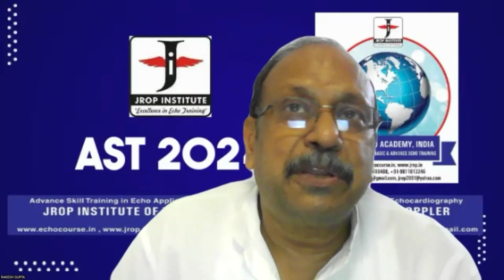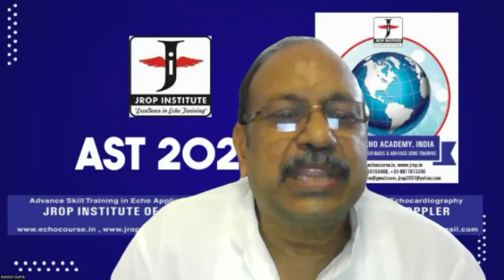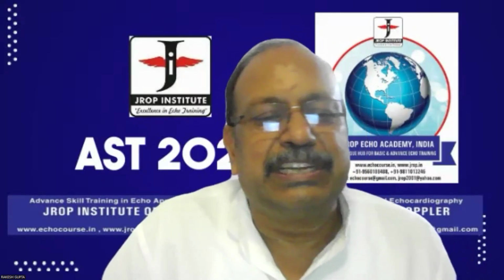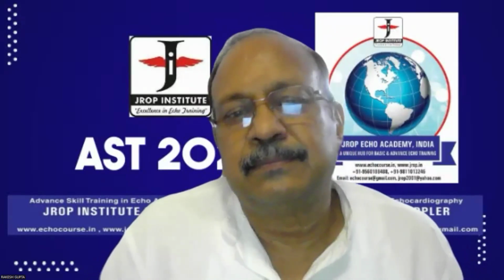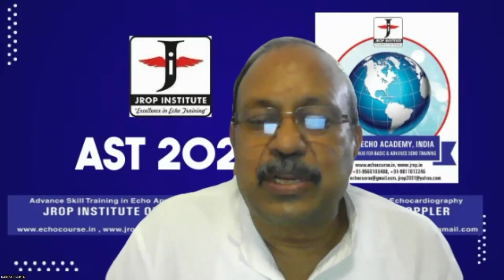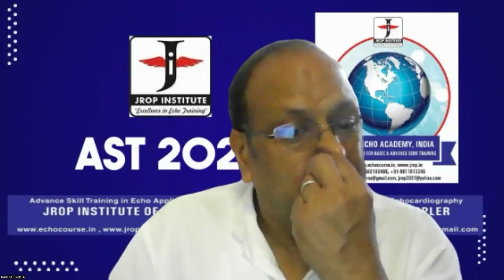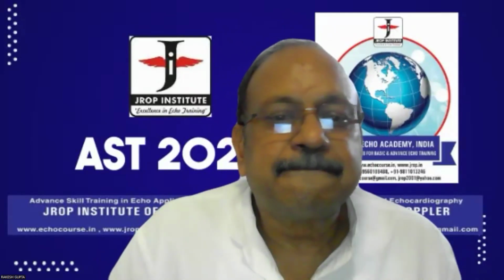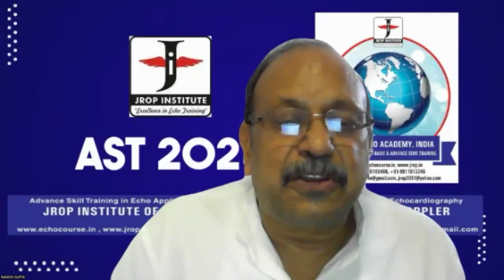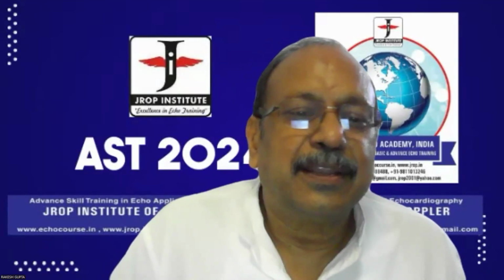Janvi, there was one paper, if I'm correct, 10 or 12 years down the line. You know what that person did? He went on to do a stress echocardiography in people presenting with atherosclerotic mitral valves with mitral annular calcifications. You know what was his outcome? Tell me what could be the outcome of that study? No, I'm not able to guess. 50% of the population had coronary artery disease. Why? Now the question is why?